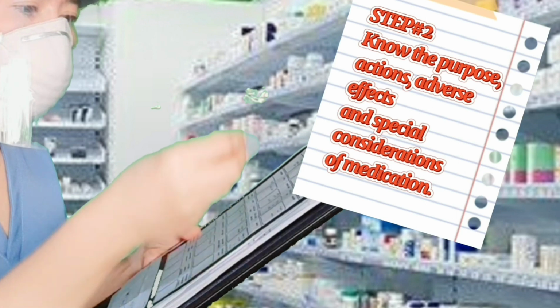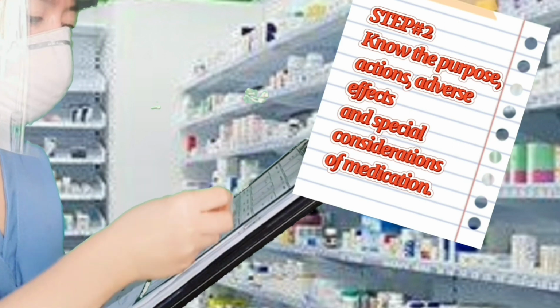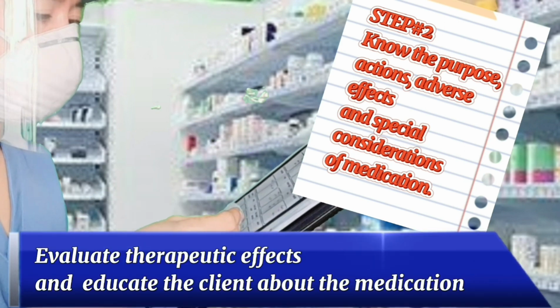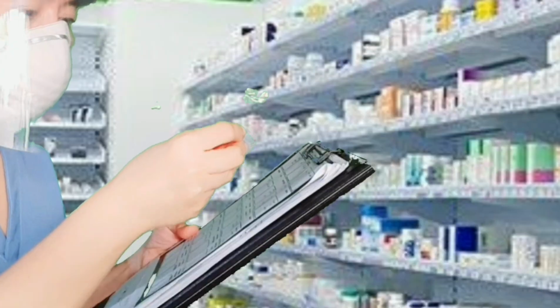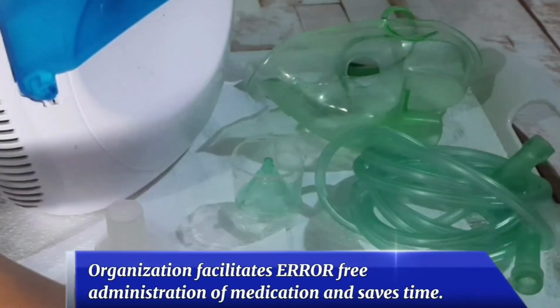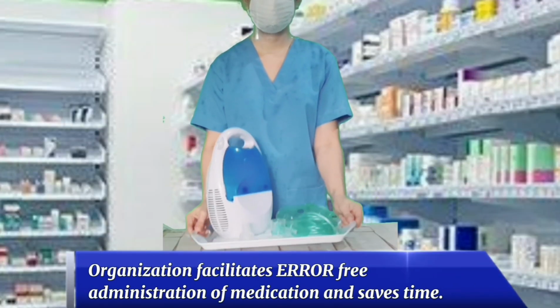Step number 2. Know the purpose, action, adverse effects, and special consideration of medication to be given to the client. By doing this, having adequate knowledge helps you evaluate therapeutic effects, and it helps you educate your client about the medication. Step number 3. Prepare medication on a tray. Organizing things properly facilitates error-free administration of medication and could save time.